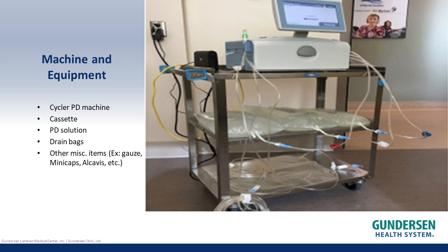This will do all of your dialysis for you. It performs all of the cycles that are required for peritoneal dialysis. So really, as a patient, you would just have to connect and disconnect from the machine. Okay. You'll also get quite a few boxes of each solution. That first initial order is going to be the biggest order that you will have. So we ask and we request it when we do our home visits that there is space for the boxes for all of our supplies and our solutions.